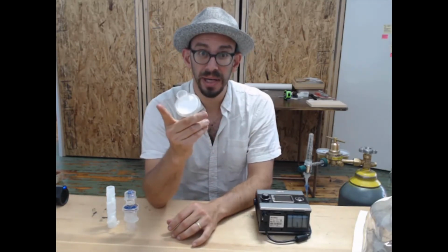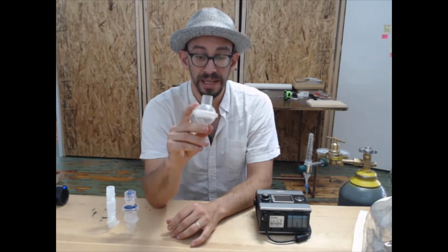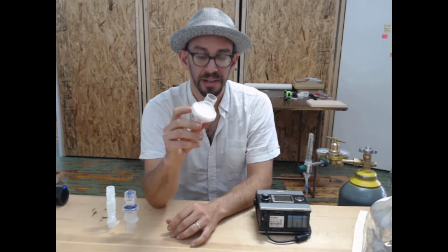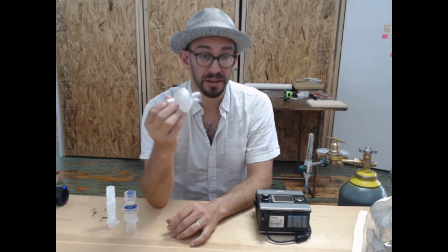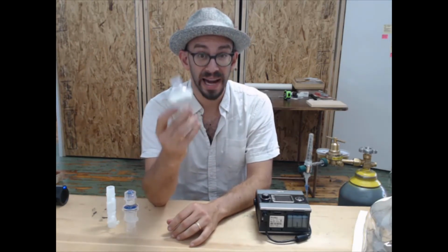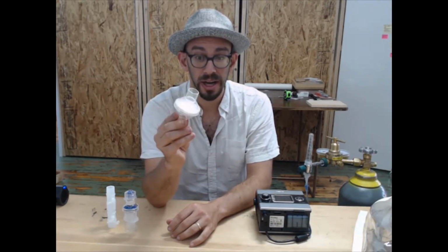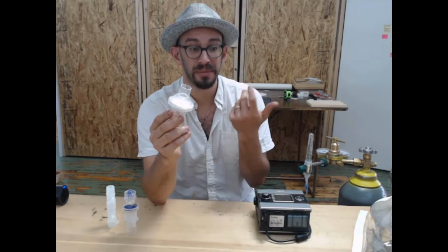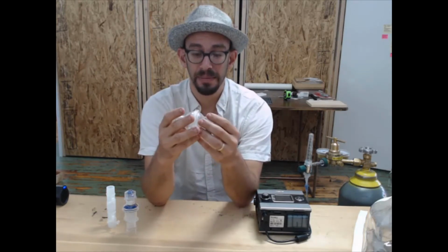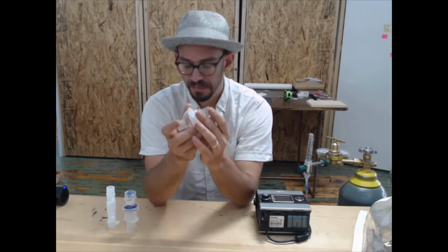And it also is the only consumable. In the US, we change these out every 8 hours in a ventilator circuit. You should work with either your own judgment or the judgment of your attending physician to ensure that you have an adequate supply of these and a schedule for changing them out. They do clog up with the patient's exhaled liquids from their breath, if they're aspirating. Any type of secretions from the patient can clog these up and reduce airflow.